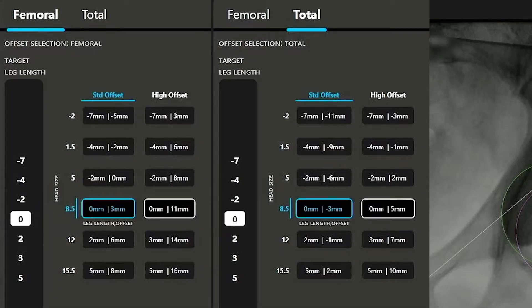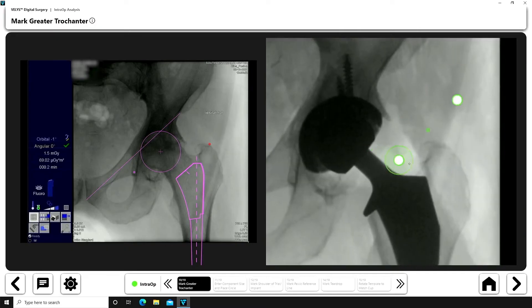At this point, I commit to the standard size 9 stem and a plus 8.5 head. My personal preference is to have a slightly negative total offset number with a positive femoral number, versus a 5-millimeter positive total offset and an 11-millimeter positive femoral offset number. I think either choice of stem — high or standard — would work for this patient. I prefer not to increase the total offset with an anterior hip approach, as patients tend to feel long with added adductor tension.